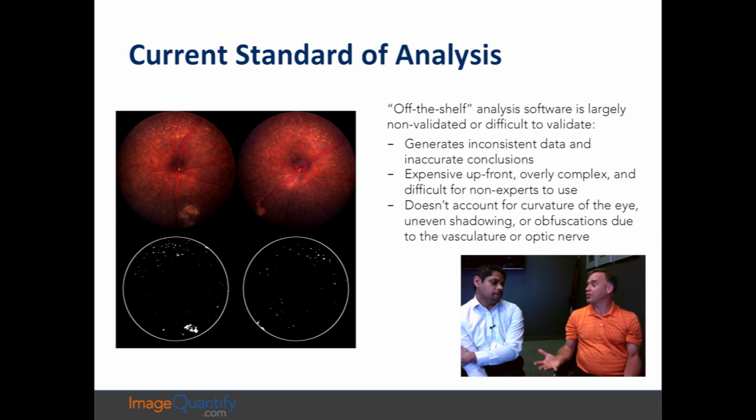From what I understand, we've worked a little bit with some of the folks who do a lot of fundus imaging at, I think, Jax and those guys, and there's some real challenges when you look at this. I think this is an example of somebody that actually tried to use ImageJ to do the analysis, but it's tricky because you've got this underlying intense image that's caused by unevenness of the actual eye itself. So you have this haze that's uneven through the eye, and then on top of it you've got lesions sitting on top of it.